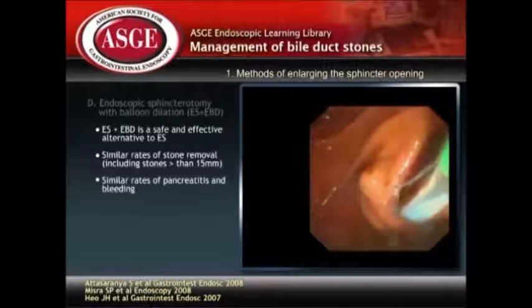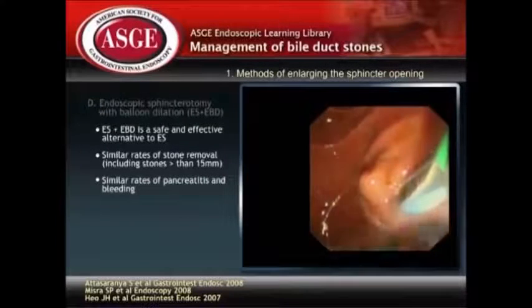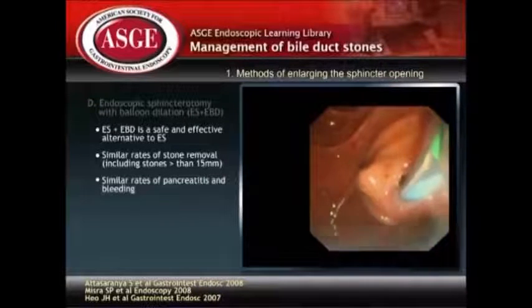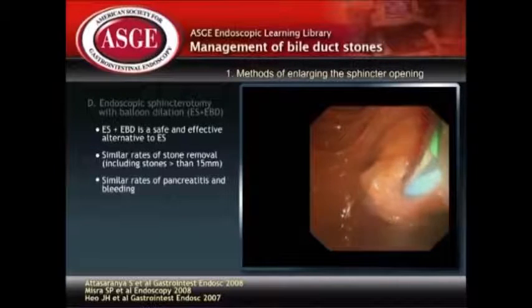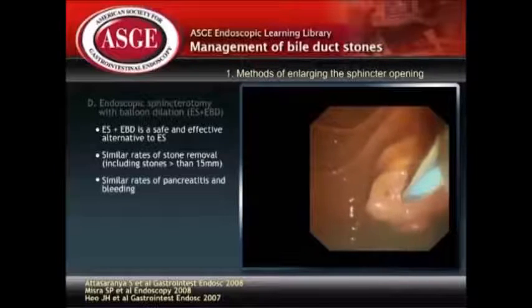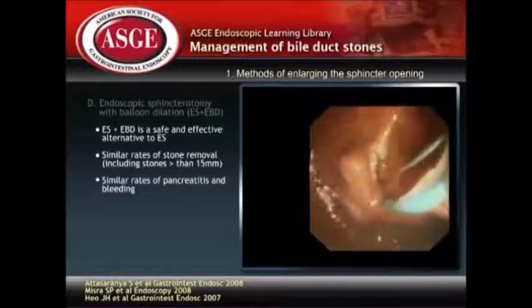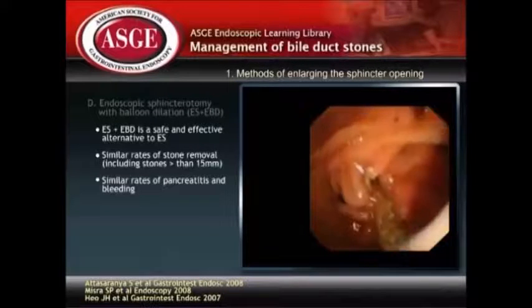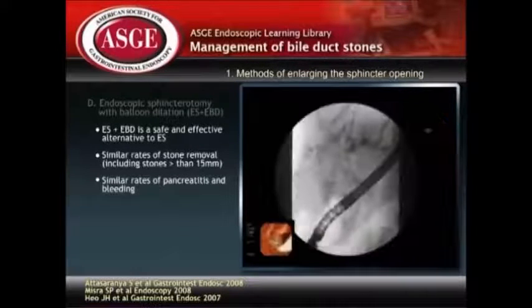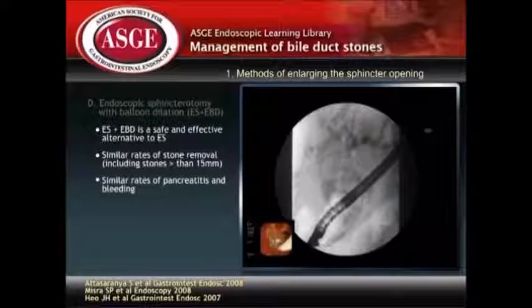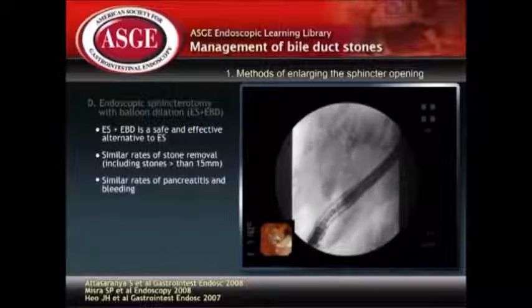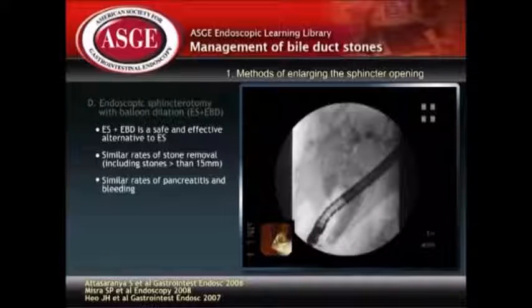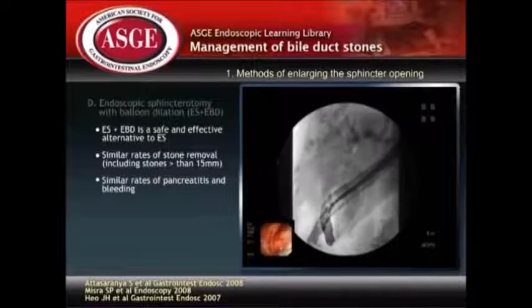The technique of endoscopic sphincterotomy with balloon dilation first involves a limited sphincterotomy, up to one-third of the size of a full sphincterotomy. A balloon catheter is passed on a guidewire across the papilla and centered at the sphincter. The balloon is then inflated and the sphincter gradually dilated to between 12 and 20 millimeters. One should observe for disappearance of waisting, and the dilation is maintained for approximately 60 seconds.